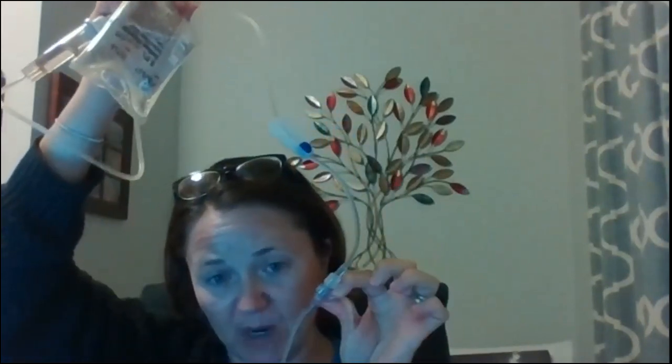Your secondary IV line set is a lot less complicated. It is going to attach into your primary IV fluid bag. It too is going to have a drip chamber and a roller clamp, but that's it. That's the end of it. Now it's attached to this primary bag. I'm going to be going over that in a little bit, but it does attach to that closest port to the primary line, and your secondary is going to hang higher. So we'll go more into that here in a little bit. So let me go back to my PowerPoint.